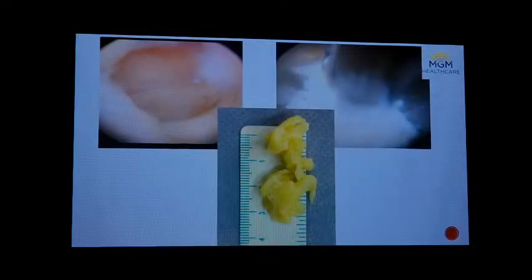You can see that you have a beautiful clear operating field, with no blood in the operating area. That's because we have tools like radiofrequency ablation, where we can have good control of the bleeders, as well as continuous saline irrigation.